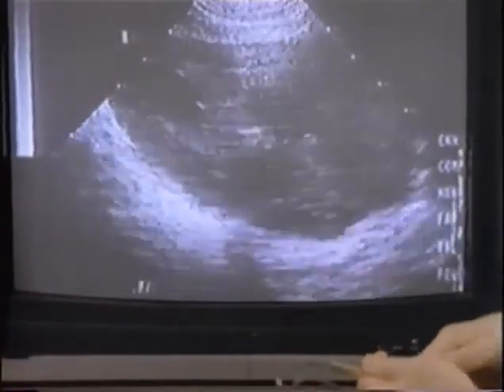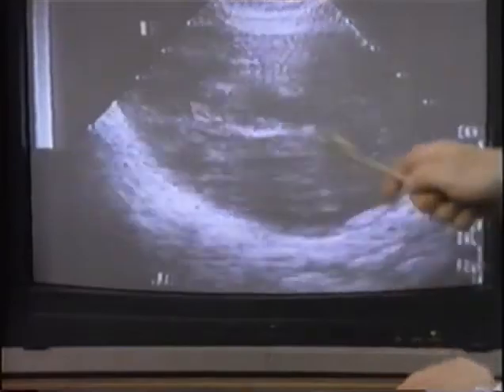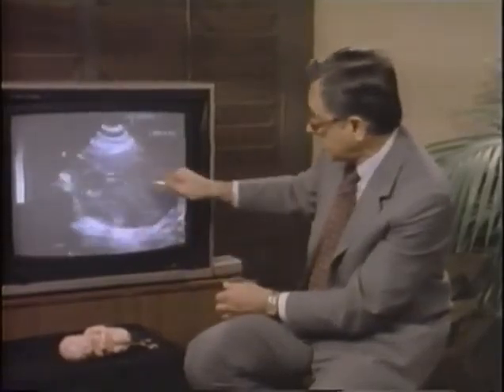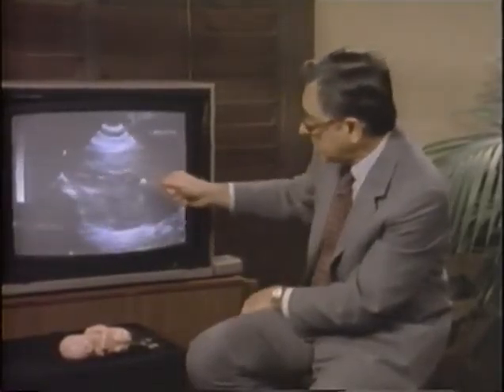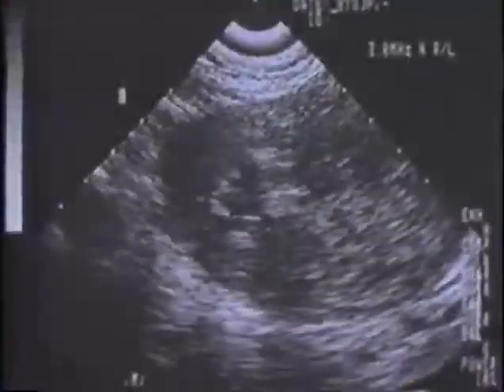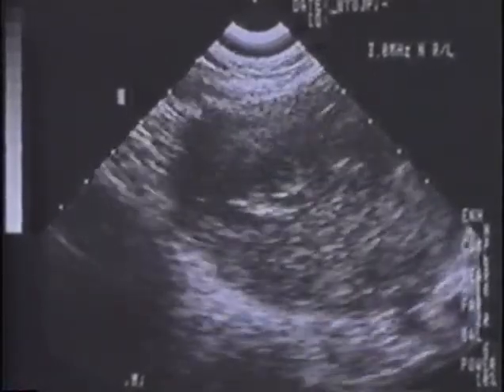We now see intermittently the shanks or blades of this instrument appearing in the image here. The head tends to float freely in the uterus. Here are the shanks or blades of the instrument coming across here. And the head is now being locked on by this polyp forceps, and the head is being pulled down toward the cervix. Now, all we see remaining are simply the shards, the broken fragments, the pieces of tissue which document that there was once a living, defenseless, tiny human being here.